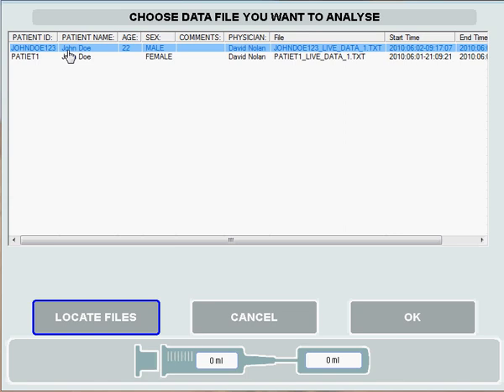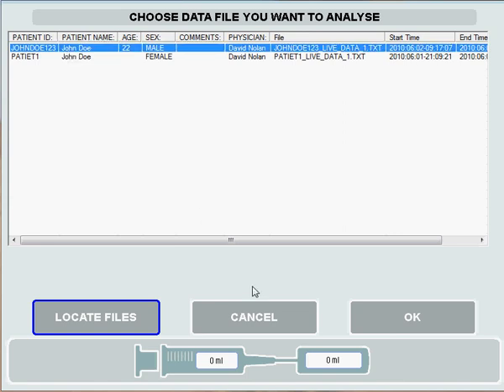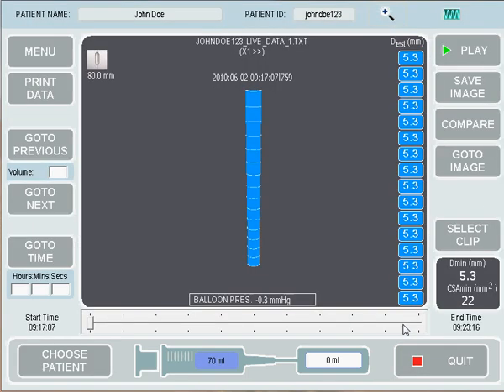I'm going to go into this John Doe patient, so I click on the patient and click OK. This loads the data from our John Doe patient.